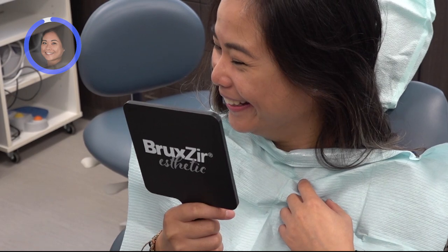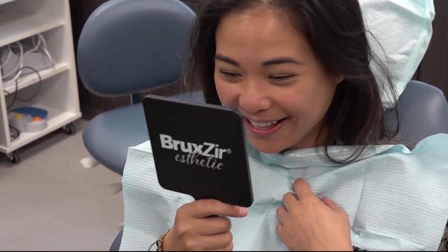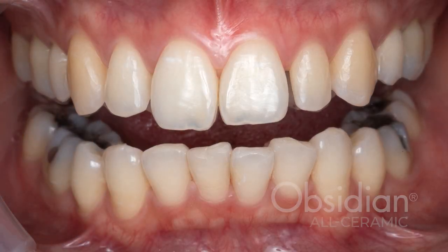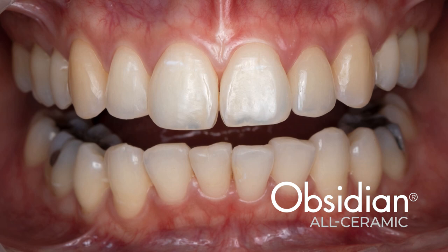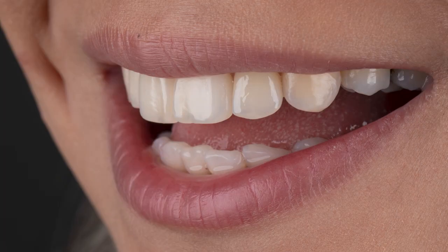The results show that the lab matched the exact shade and shape that the patient had always wanted since she was a child. The aesthetic appearance of the obsidian crown exceeded her expectations by blending naturally with her surrounding dentition. This case report demonstrates how digital chair-side workflow can simplify aesthetic cases.